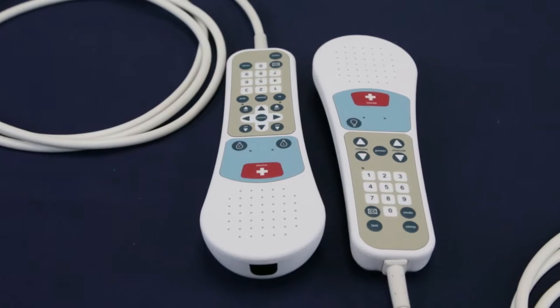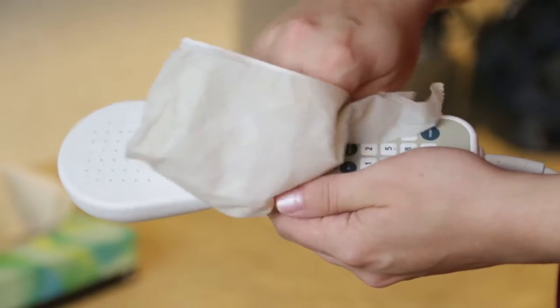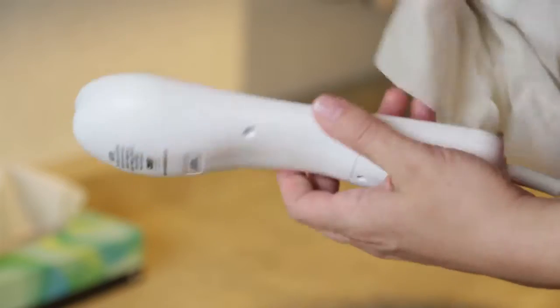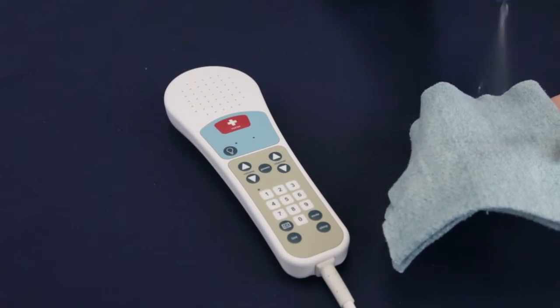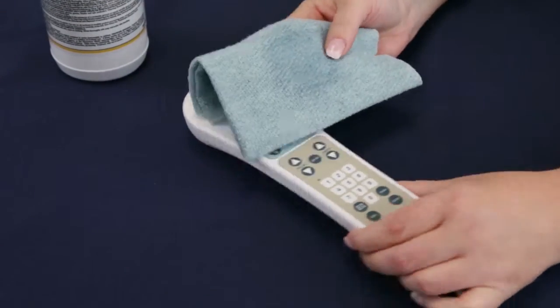Crest Elite pillow speakers have been designed and manufactured with water-resistant and infection control in mind. To clean the pillow speakers, use a soft cloth dampened with warm water and a neutral detergent, or antibacterial wipes.